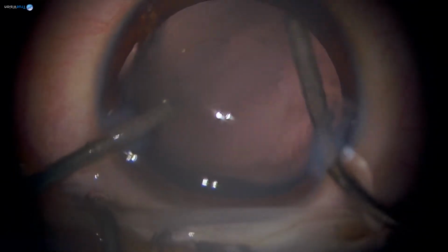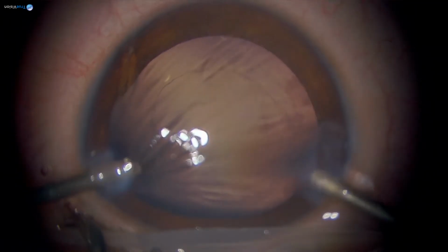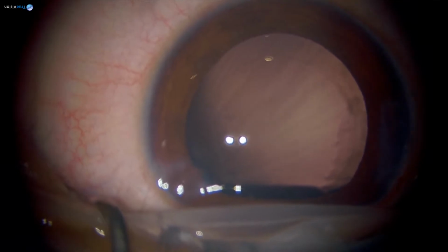Right now, what I'm doing is I'm polishing the anterior capsule, the posterior part of the anterior capsule. There are tiny epithelial cells you can see. We're able to see it very clearly, sir.